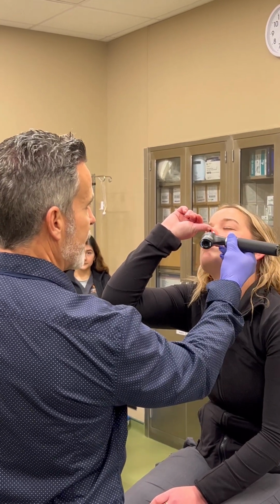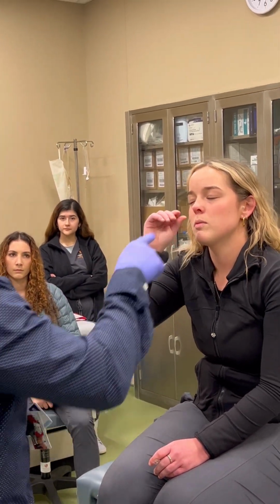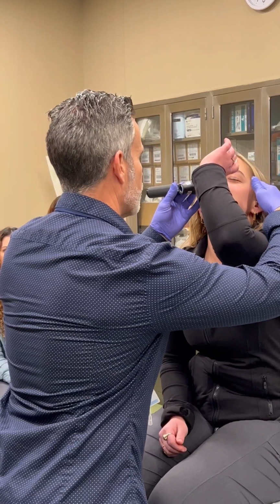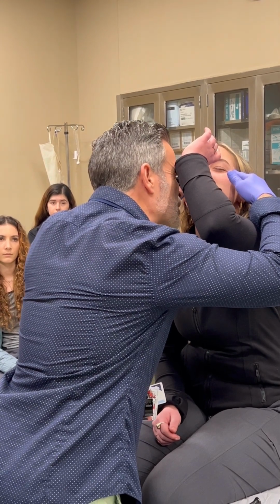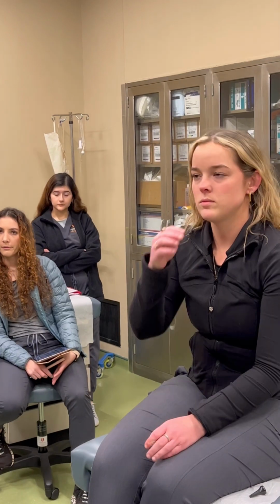We just lay it on the edge, and then you can tell the patient to hold their breath, and then you can actually go in and look. So we'll do this side. Don't let her breathe out of her nose. Come in here, get really close, and you can look at the mucosa. That way you can see the blood vessels and everything you need to see. I won't do the other side since she has the ulcer, okay?